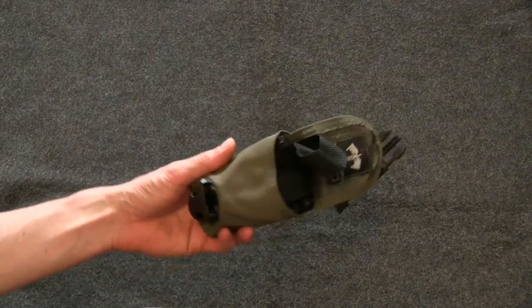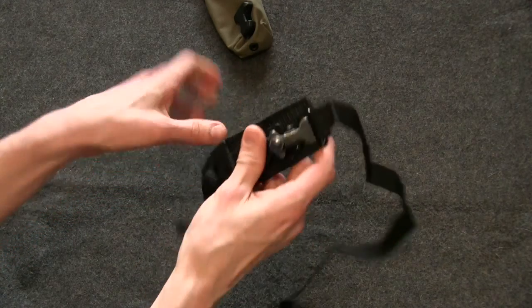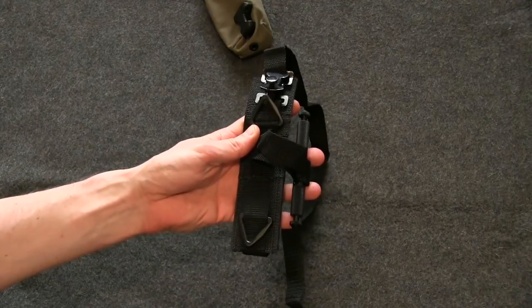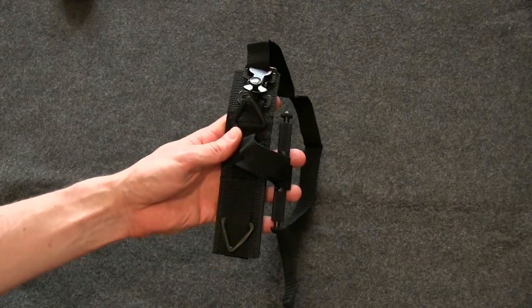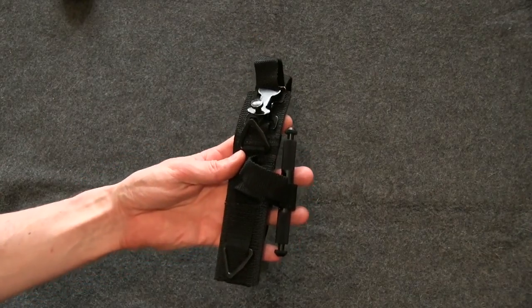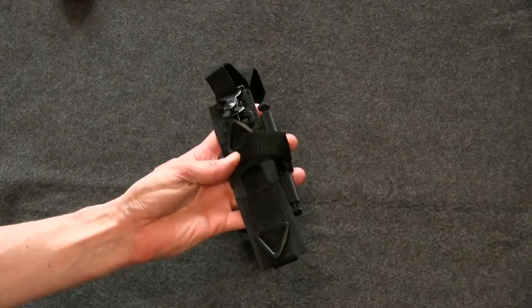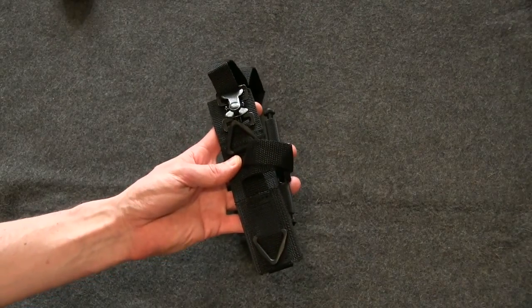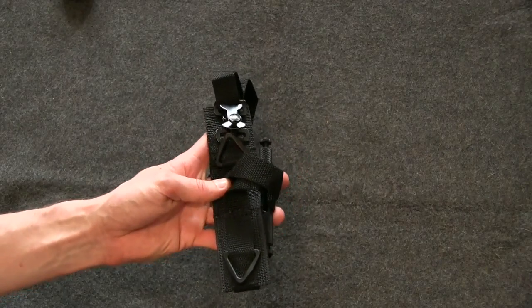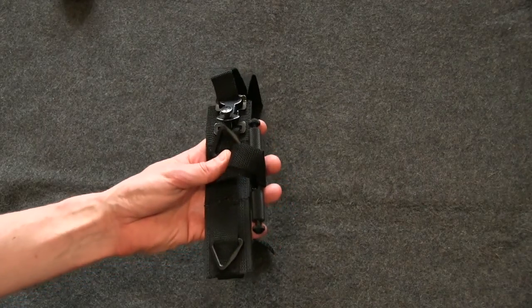Now I would say that it's a quite easy to use product. Of course, these kind of products should be, and have to be, really easy. If I compare this to the CAT, which might be the industry standard currently, the CAT has Velcro, and Velcro is quite nice, but if you have to work in a very dirty environment and you have to crawl around in a forest, you can quite easily get the Velcro in such condition that it doesn't really stick anymore.